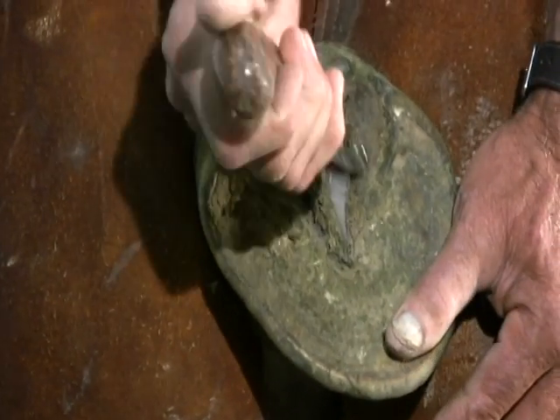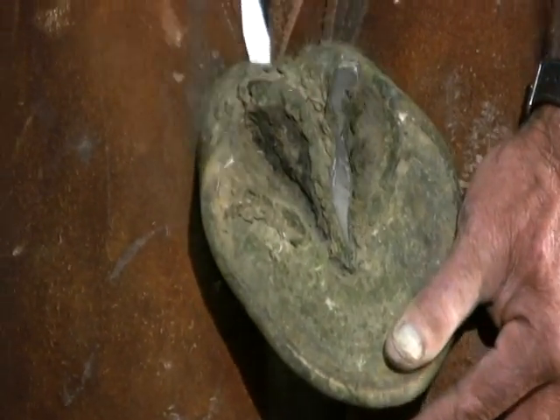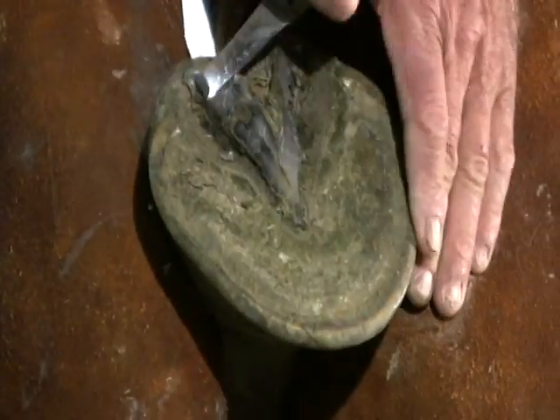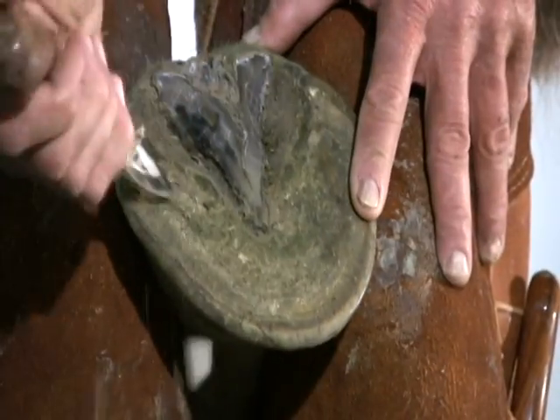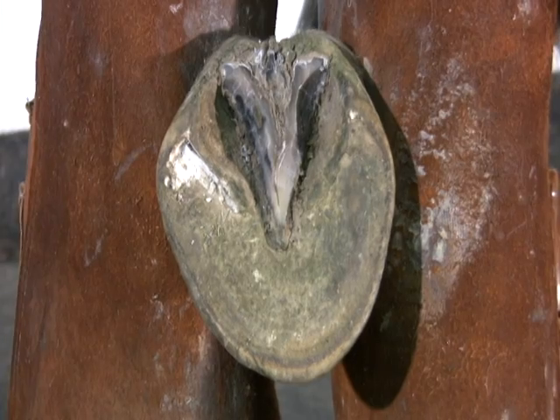The first step is to clean the frog to prevent the rubber from becoming trapped in the sulcus or under overlapping frog tissue, but leave all excess horn — Dr. Redden may need it for the therapeutic trim. After cleaning the frog, this is how the foot should look.